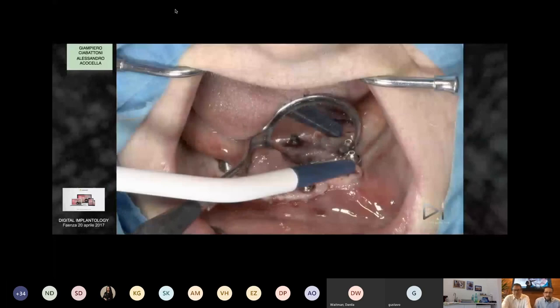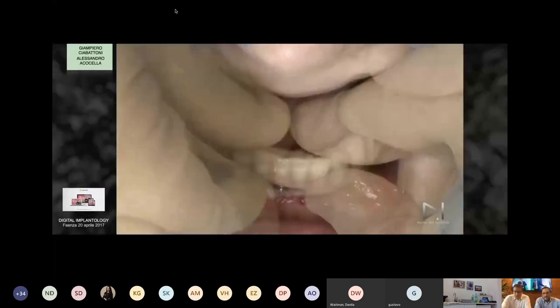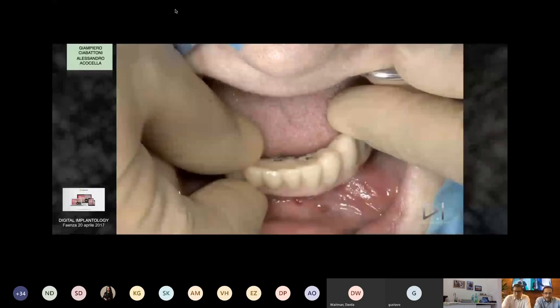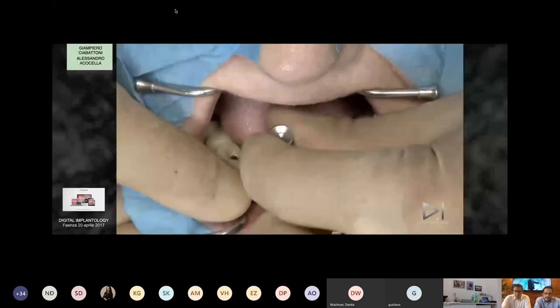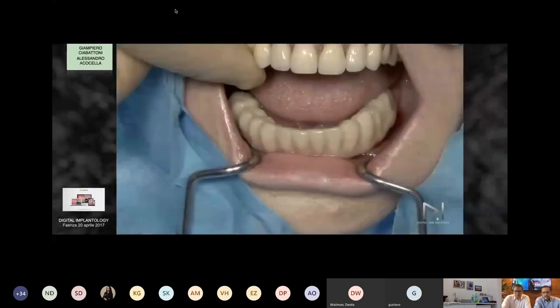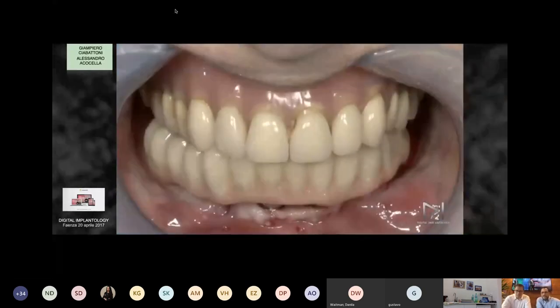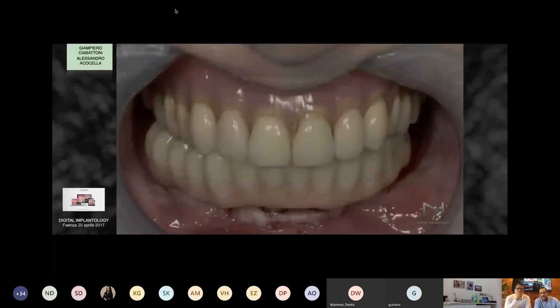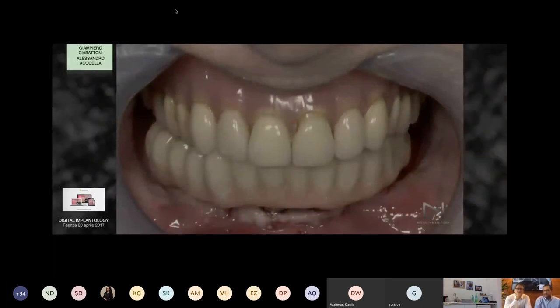And this is the very first moment that we enter with the pre-made prosthesis into the mouth of the patient, try to engage some screws. We first try to tighten these prosthetic screws. And when you have this kind of condition, occlusion at the very end of the surgery, you have to be sure that you have control of all the steps and you did the right work.